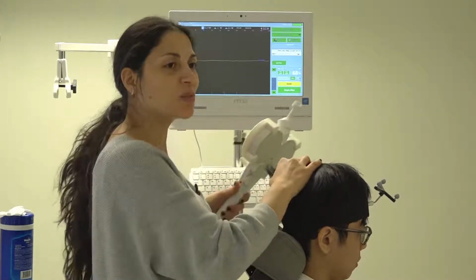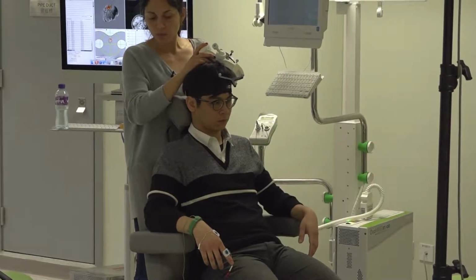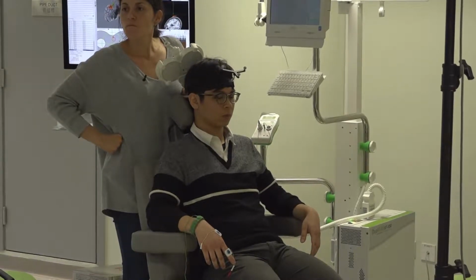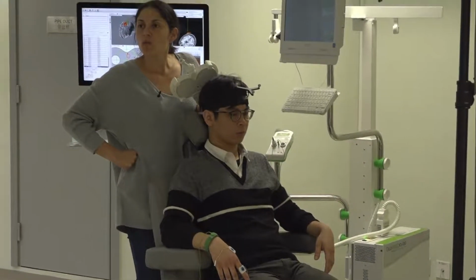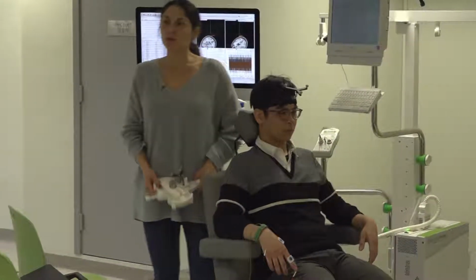It has never happened to me that it takes so long to find a spot. So sometimes we have a kind of adaptation to the stimulus. So would that also happen in the TMS stimulation? Yeah. Because you found the hotspot. No, I didn't. Just now you found it, right?